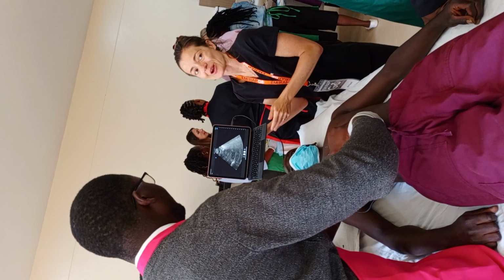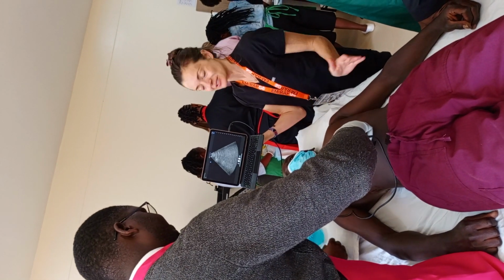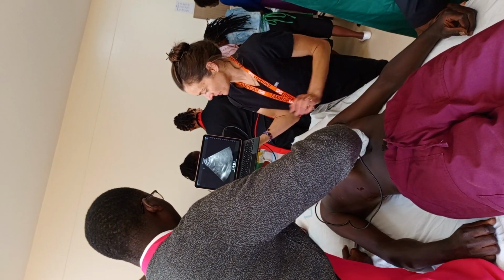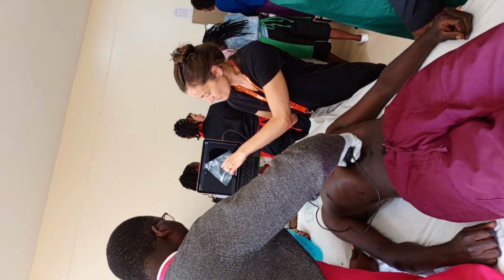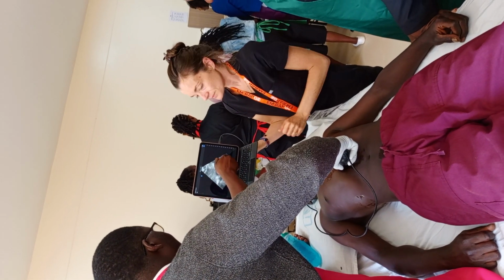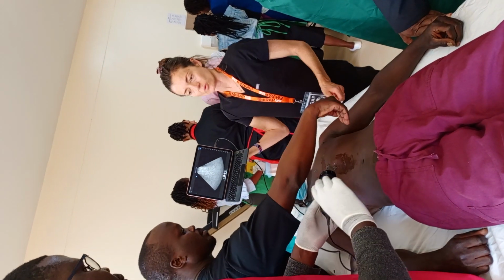Sometimes the subxiphoid can be hard after people eat because they've got food in their stomach and the intestines are moving a lot, so it can just be a little bit harder to ultrasound people in general after they eat. Okay, there we go. Beautiful. All right, and then we're gonna go to the left upper quadrant.